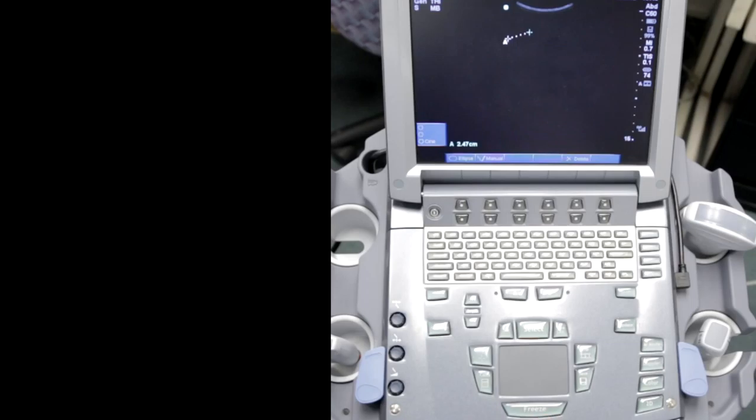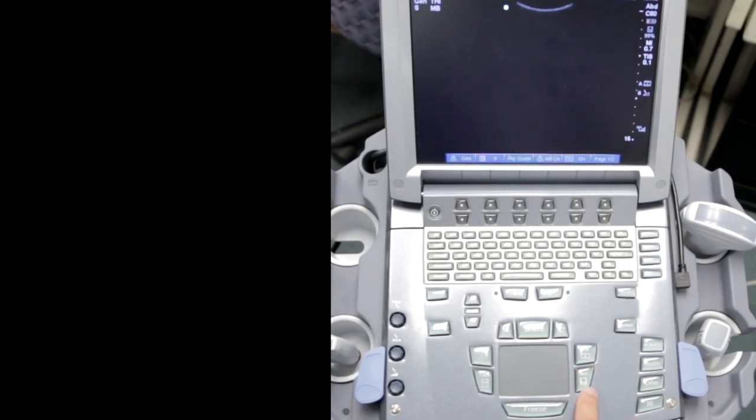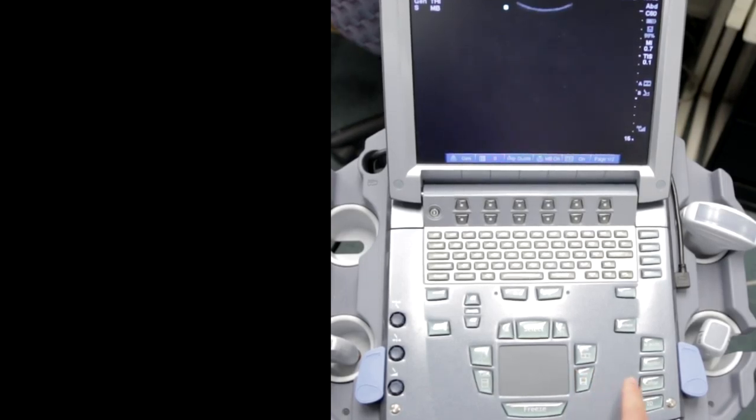If you want to save an image, you can push freeze and save the image here. This will save one image, just a still image.